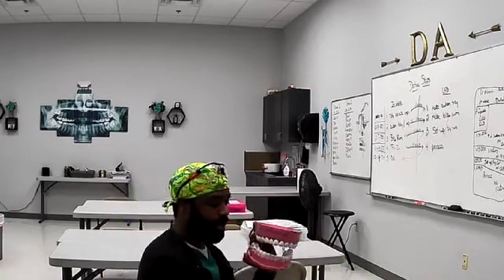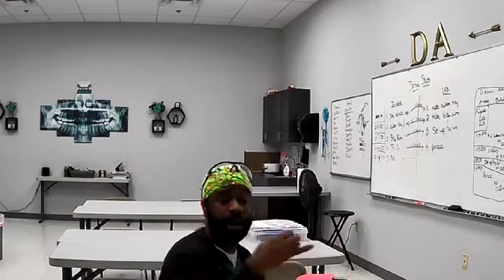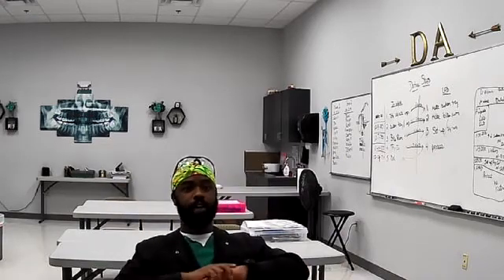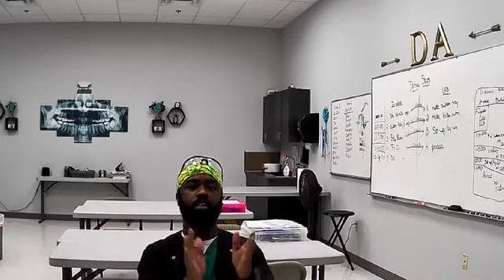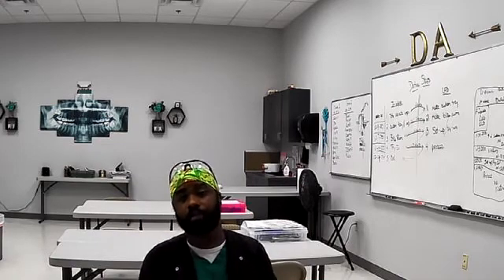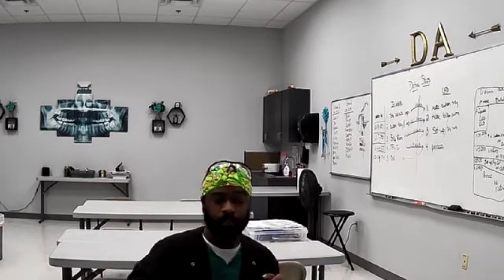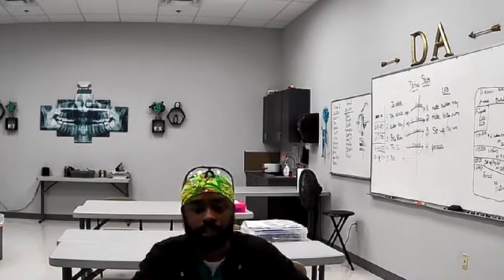At the end of taking all of your X-rays, the bitewings, your posterior PAs, and your anterior PAs, once you're finished with all of those, you will have every single tooth in that patient's mouth in the chart. It's different than a panoramic, the pano, the machine that you have to hold and it circles around your head. It shows a little more detail with PAs and bitewings.